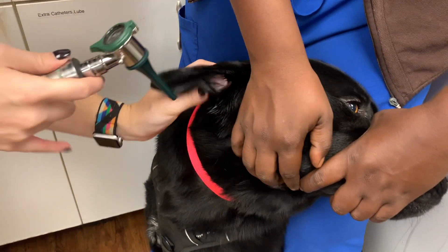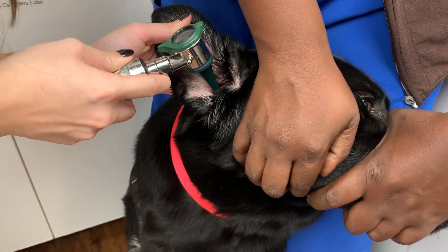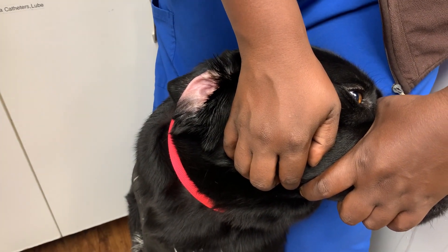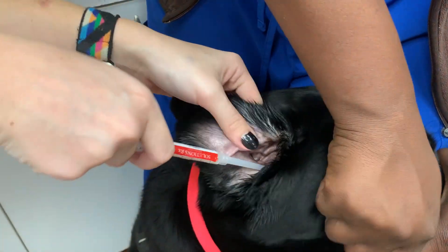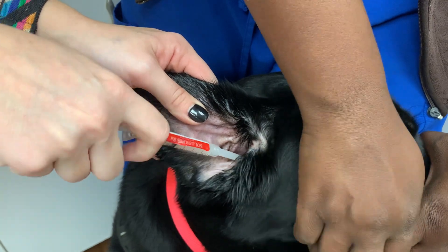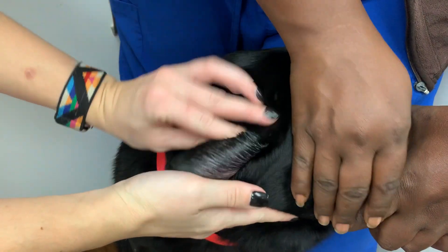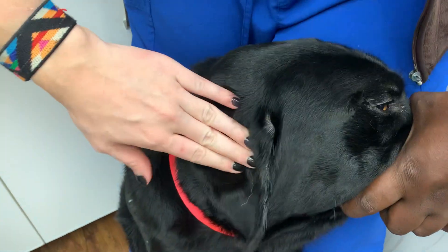I double check that everything looks clean before I insert it on this side. Now I'm going to insert the medication on this side. And that is how you clean and medicate a canine's ears.